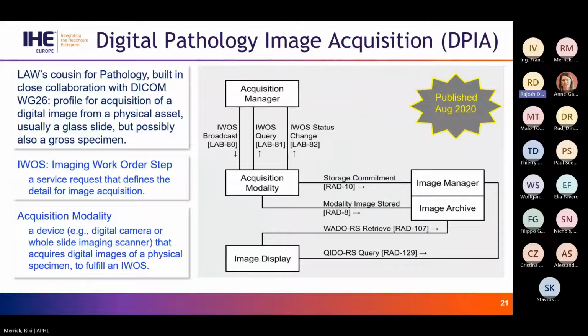All right, so this, as mentioned, is the laboratory analytic workflow's cousin for pathology, built in close collaboration with DICOM.